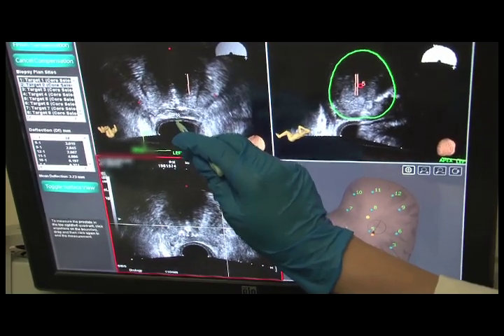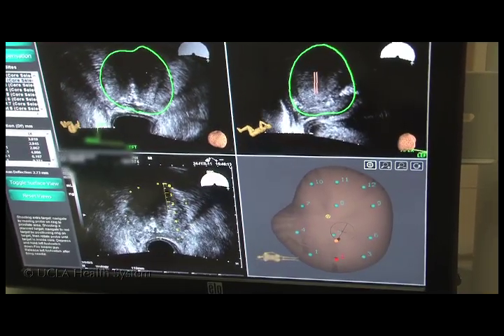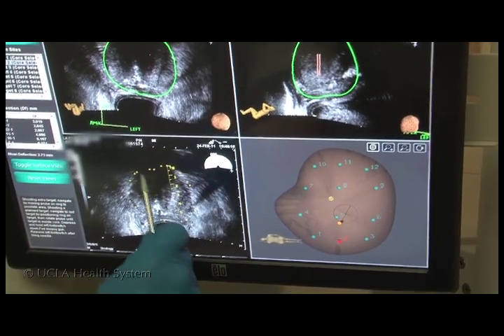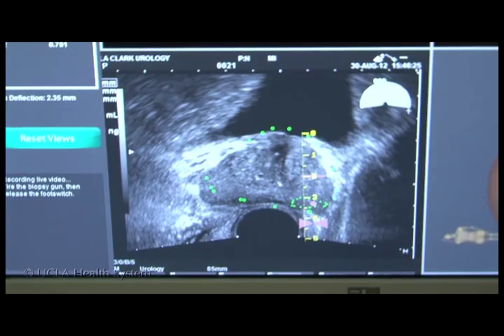The prostate can move either by its movement within the body, or the whole body of the patient can move, distorting the image fusion. Therefore, built into this device is motion compensation software, which allows the tracking mechanism to return to the original site of the prostate.